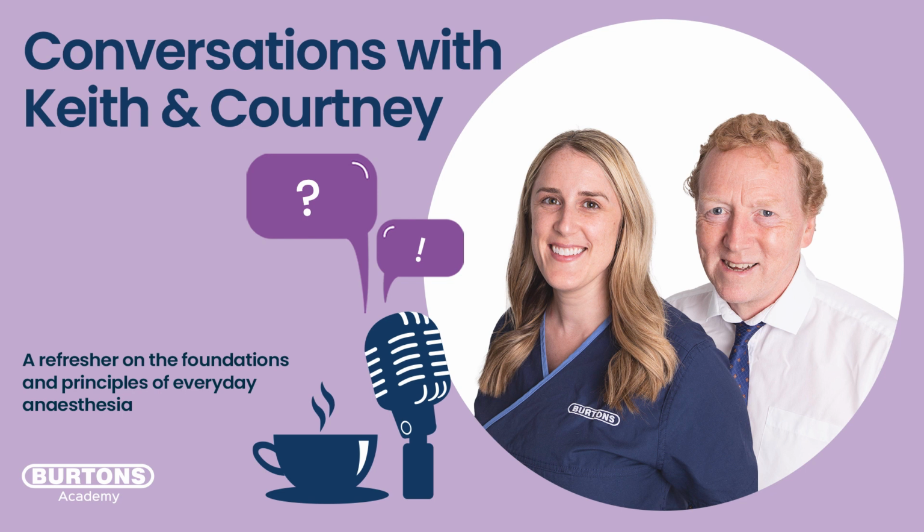And I think that's what we maybe want to look at now. Let's start with small animal practice, because I think most of our listeners will be in small animal practice. We can talk about horses or exotics or whatever at another point. So actually most things there are going to weigh, let's be generous, between 200 grams for those people who are brave enough to be doing some sort of rodent or exotic surgery, and up to 60, 70 kilos. So we're going to go from a few hundred grams up to 60, 70 kilos.